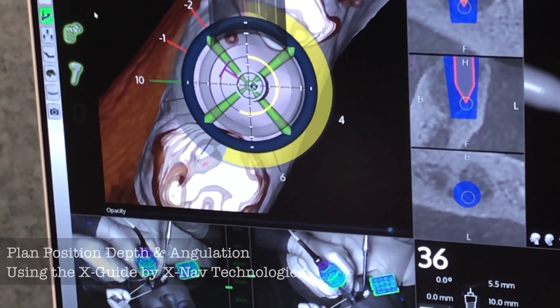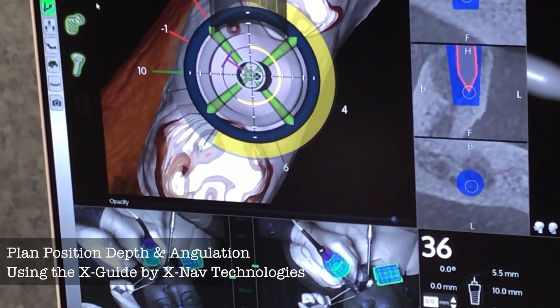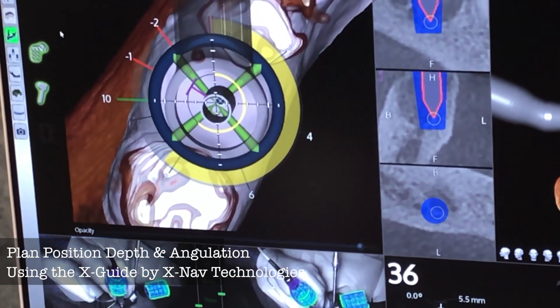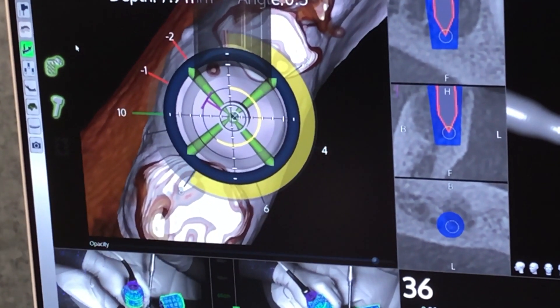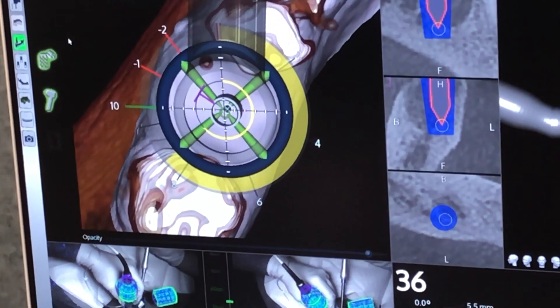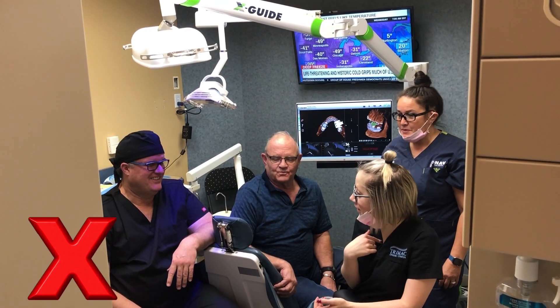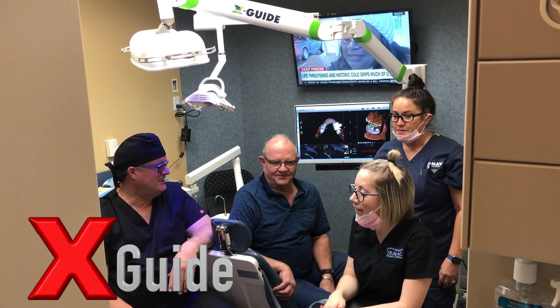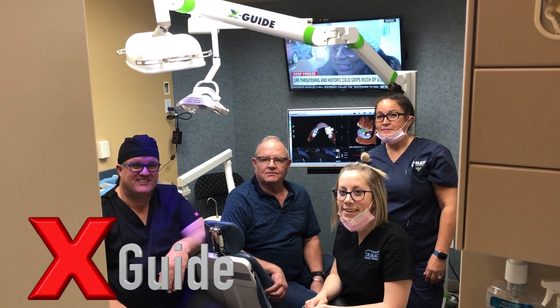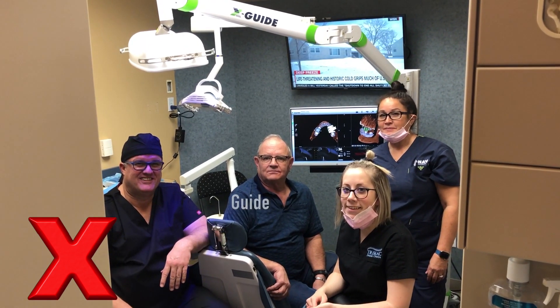In summary, our goal is to develop a plan to get position, depth, and angulation and then to deliver that to the patient using the X-Guide system from X-Nav Technologies. This is Dr. Scott McLean and this has been a YouTube video about implant dentistry, specifically about the X-Guide and how to move files from DTX Studio Implant into the X-Guide software.